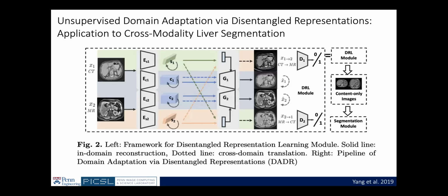So I think I've covered the main concept. I'll just go through a couple of papers. I'll share the slides, you can look them up. Exactly the same idea that we discussed in that slide. Here the task is you want to segment abdominal regions in your images, but at training time, you're giving a lot of CT images and you don't have much information about MR images.